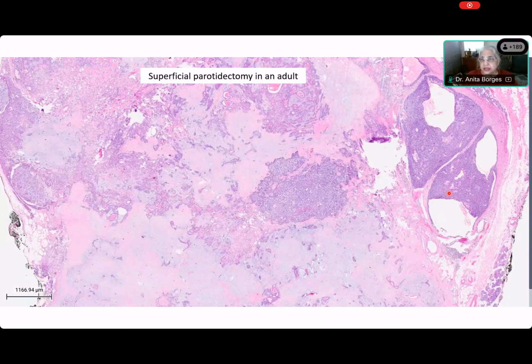Do they form a pattern? Is there anything that you want to say about it? They seem to form lobules. So now you're calling these lobules, huh? Nest or island. My God, Akshara, you don't see that these are nodules which are partly cystic and partly solid. So you're seeing areas that are solid, and areas that are cystic. The cysts are large, the cysts are small. You can see that. So there are microcysts, there are macrocysts, there are solid areas, there's myxochondroid. And yes, there is a basaloid appearance that can be seen quite prominently in this particular section.